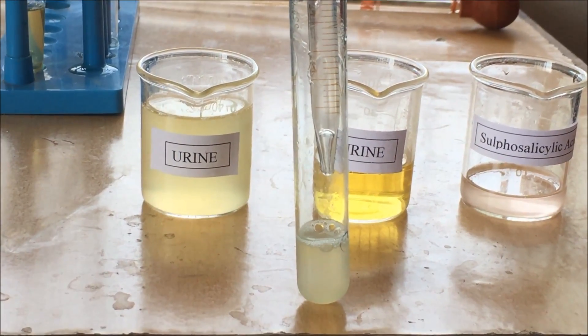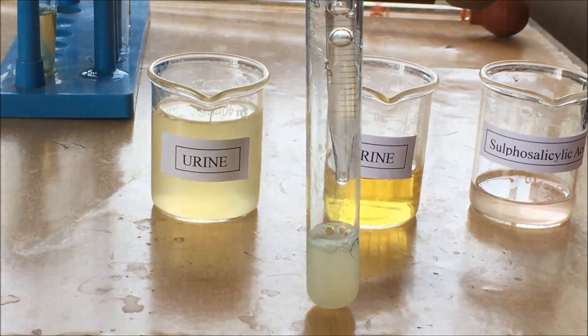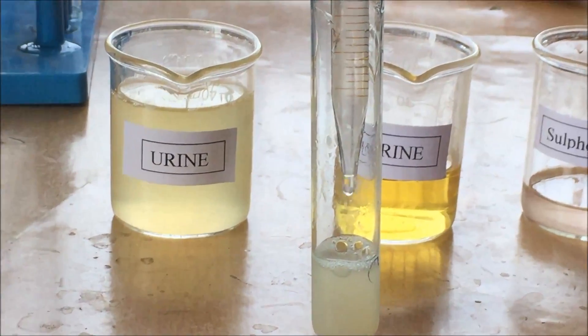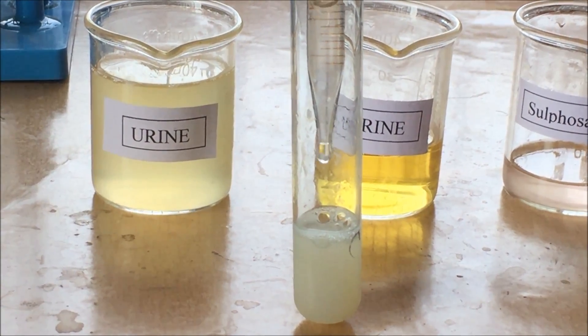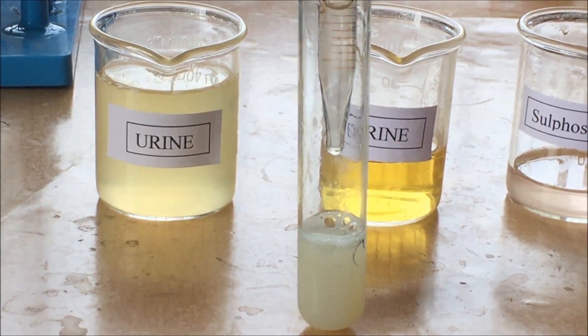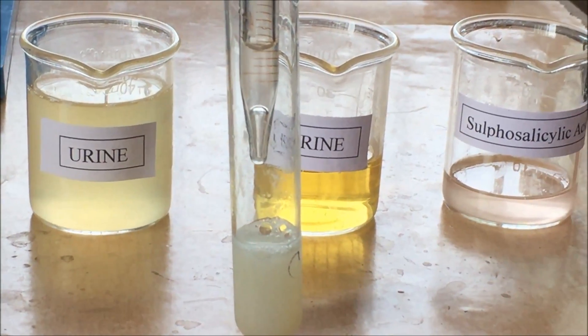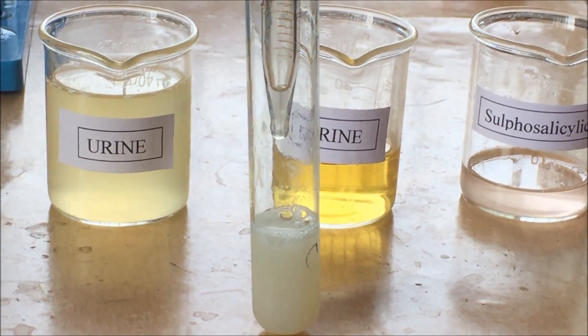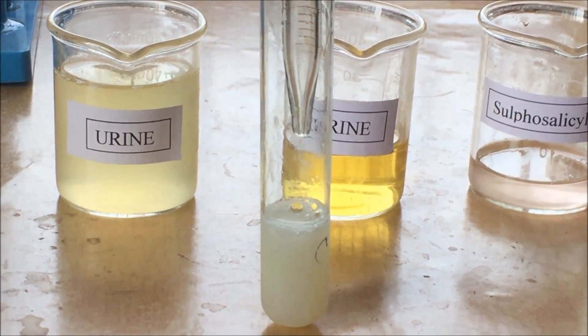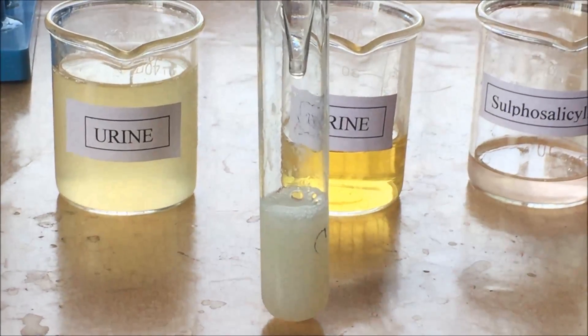Now clearly observe the change in color of the urine mixture. This is changing to slight cloudiness, slight turbidity. When we increase the drops of sulfosalicylic acid, the turbidity increases respectively. The change in turbidity indicates the presence of albumin in the given sample of urine. Here the sample was egg albumin, water, and urine. Thus it confirms the presence of albumin in the prepared mixture.